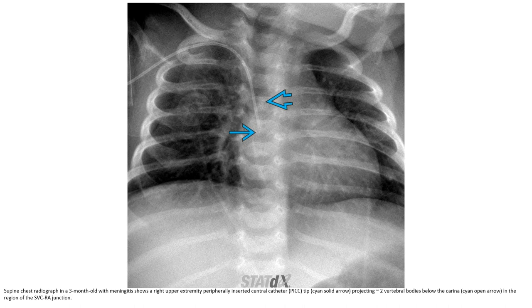This is a supine radiograph in a three-month-old patient with the right upper extremity PICC inserted. The tip is at two vertebral bodies below the carina, in the region of the SVC-RA junction.